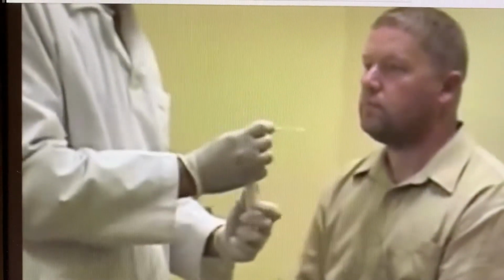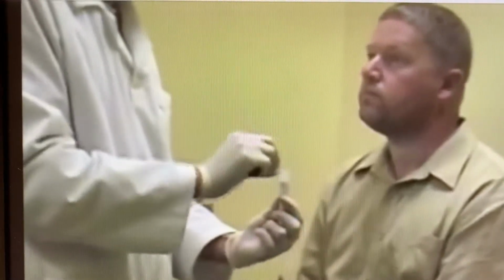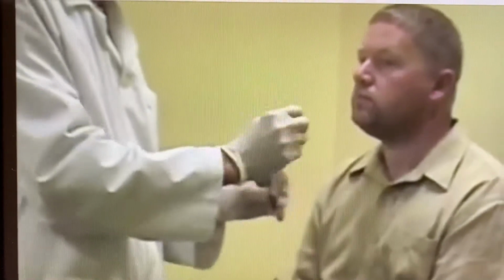With the patient seated and head tilted slightly back, insert the swab along the base of the nose and along the medial septum. If resistance is encountered, rotate the swab slightly or try the other nostril. When you reach your pre-measured distance, rotate the swab to dislodge epithelial cells before withdrawing it from the nose. Place the swab in the collection tube, snapping the end first. Label the tube with the patient's name and another unique identifier, as will be discussed shortly.